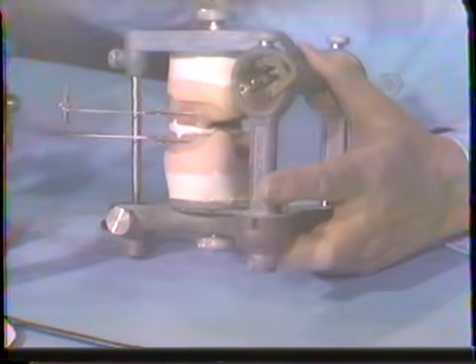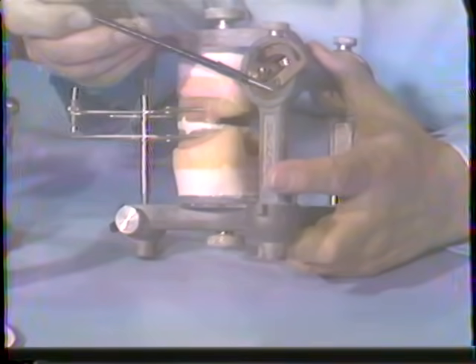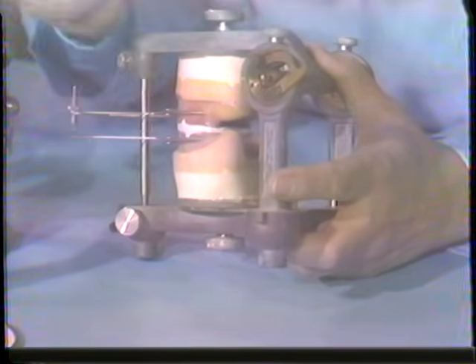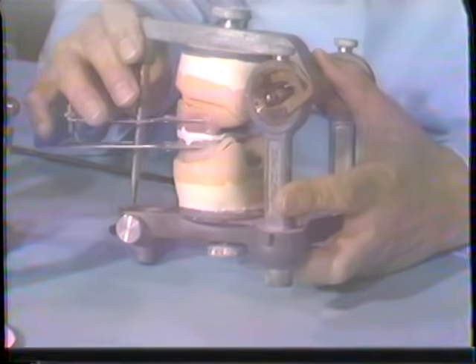In this particular one here, the path is attached to the lower member of the instrument. The path in which this condylar element rides is attached to the lower member of the instrument, and the axial center actually is attached to the upper member of the instrument. In other words, it's directly opposite to the other one. That's why one is called arcon and the other one is called a non-arcon instrument.